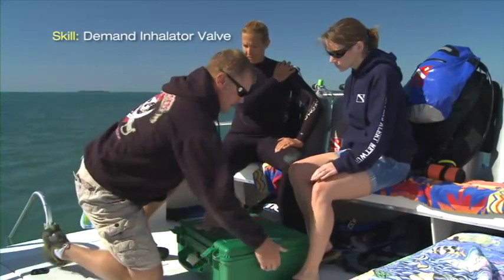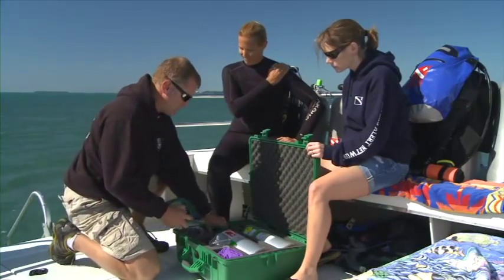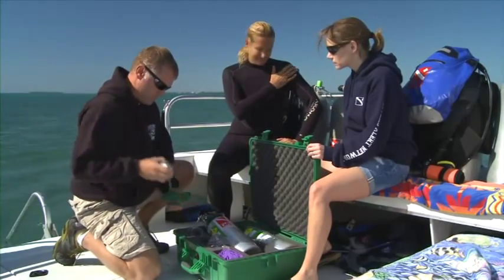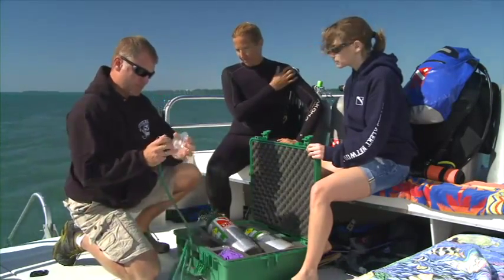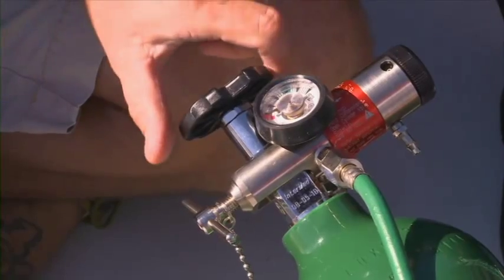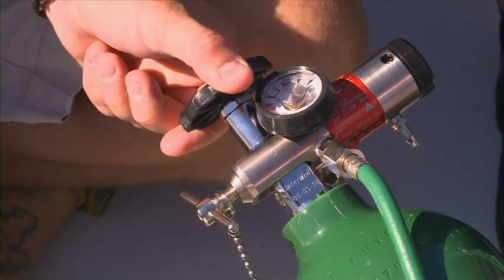If the diver is breathing normally, provide the highest concentration of oxygen possible. Deploy the oxygen unit. Open the cylinder valve with at least one full turn and check cylinder pressure.